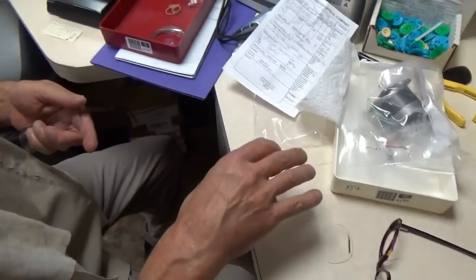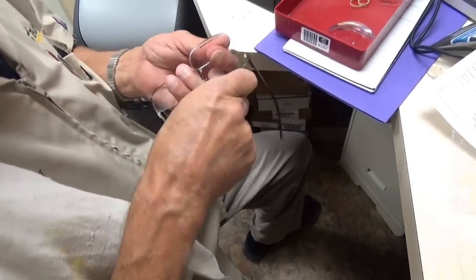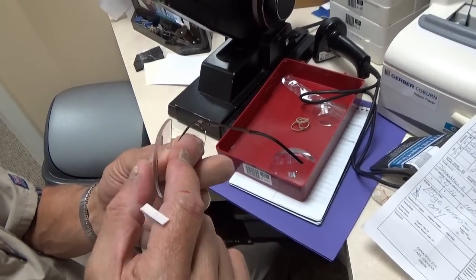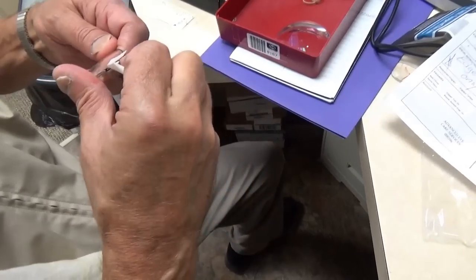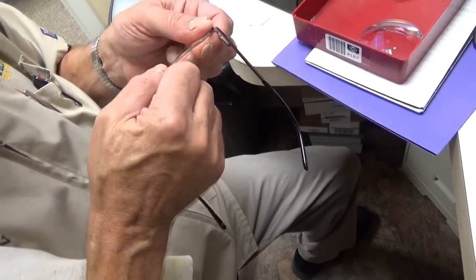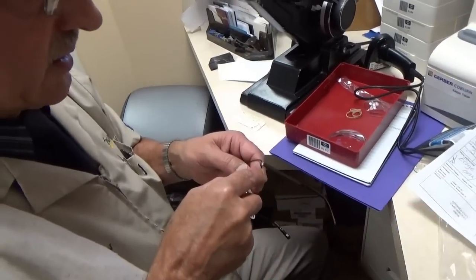A rimless frame is done a little differently. The lens is held in with what's like a fishing line — you can see there's a groove that goes around the lens. There's a plastic liner up here that you line that with. These lenses have the opposite: instead of a ridge they have a groove.